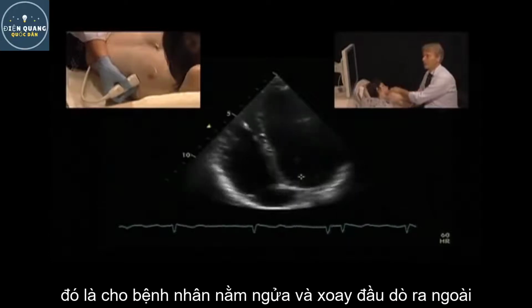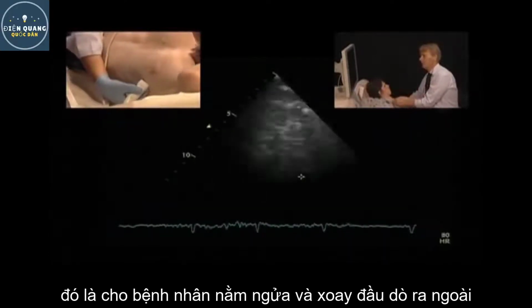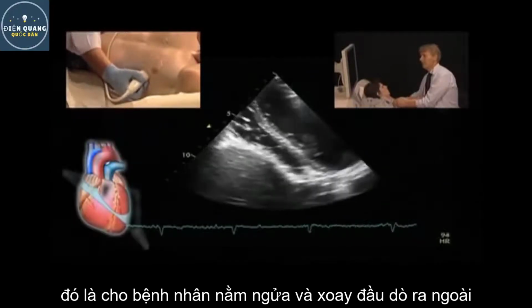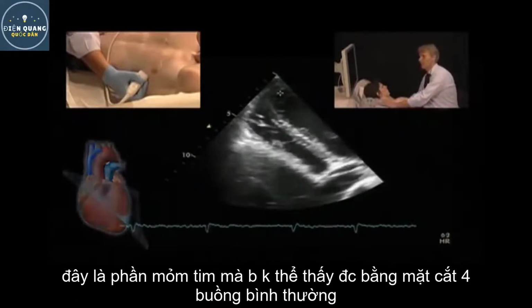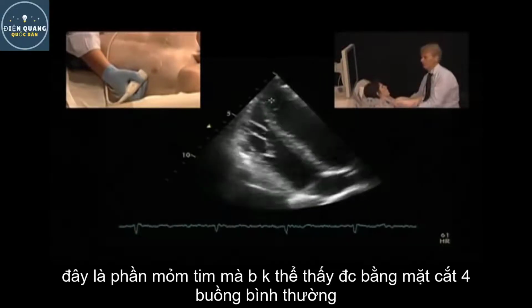If you really need to see the superapical views, there's another trick that you can use, and that is by bringing the patient more in a position on the back and rotating the transducer very, very laterally, and then all of a sudden you will get views which are very atypical, but which do show you regions of the apex that you cannot see with even the optimized four-chamber view.